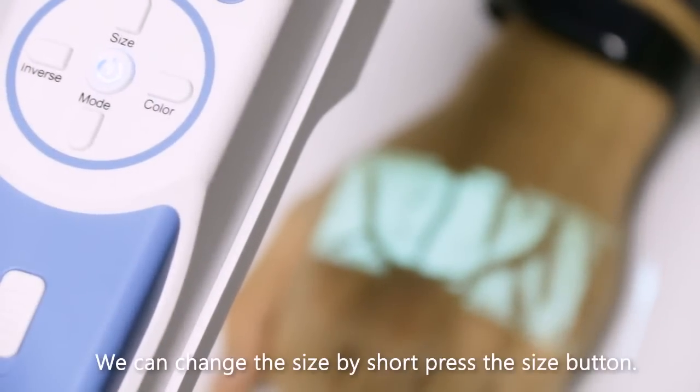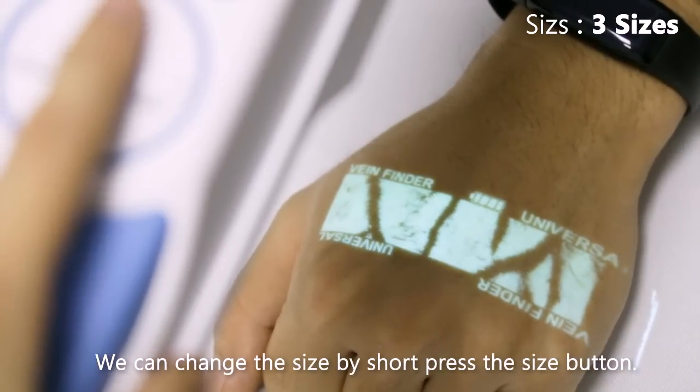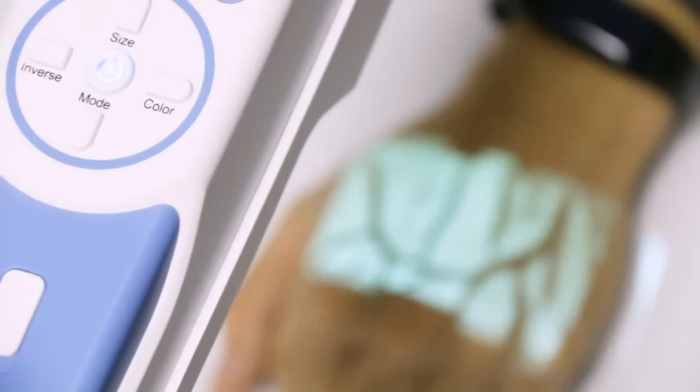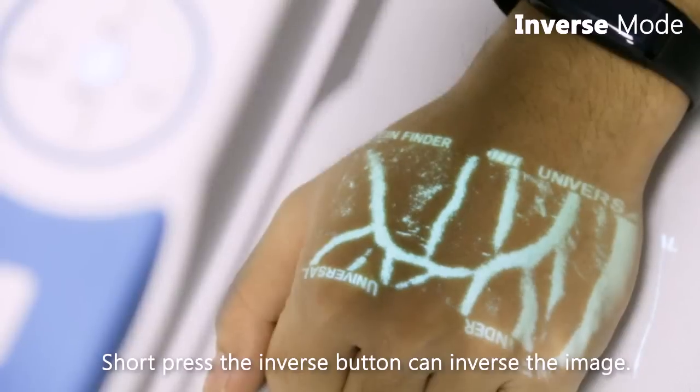There are three kinds of sizes. Change the size by short pressing the size button. Short press the inverse button to inverse the image.